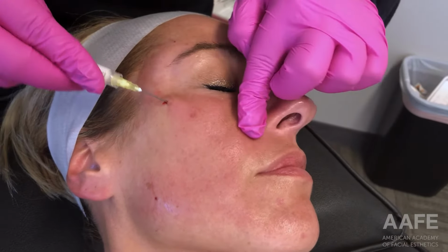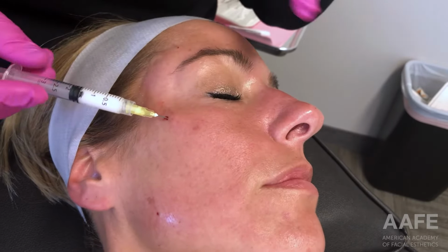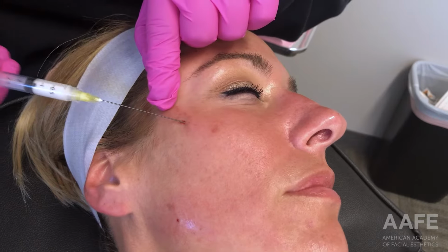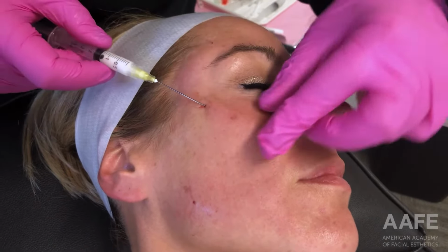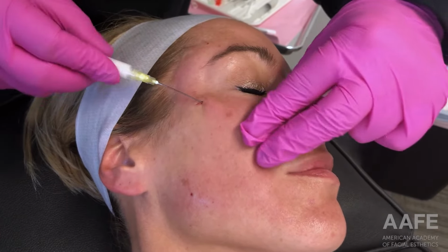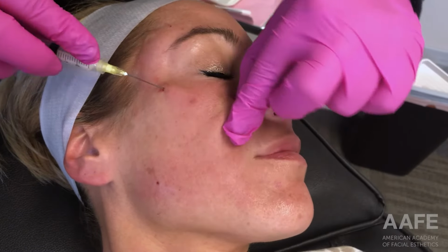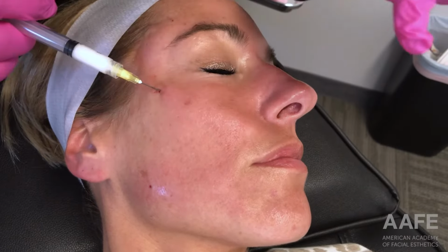And we're just going to fan this material into the treatment area to make sure that we stimulate really good collagen, get a nice good collagen response. And so we are going to just, again, enter in through our one entry point and fan the material out. So that way you get a nice treatment and a nice response of that neocollagenesis.